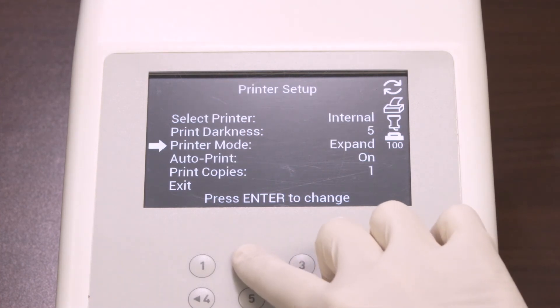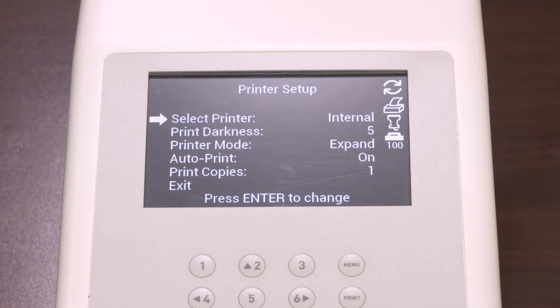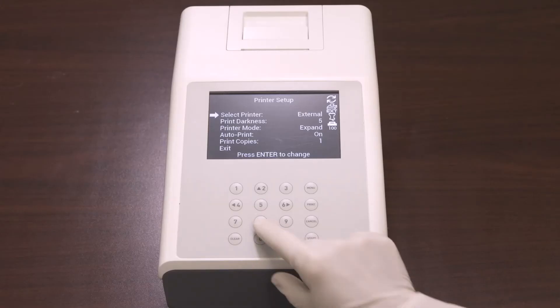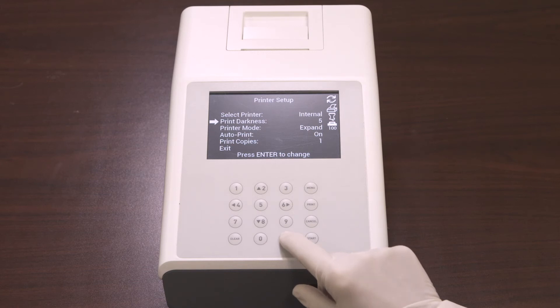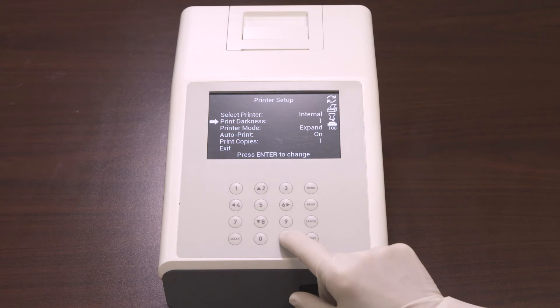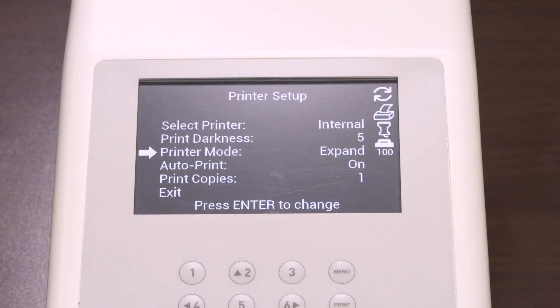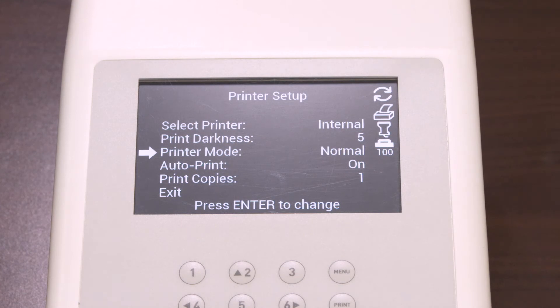Choosing internal in the select printer option prints the results on the internal printer. Choosing external prints the results on an external printer. The next option in the printer setup is print darkness, which provides the level of darkness in the display. It ranges from 1 to 9; the darkest is 9 and the default is 5. The next option is the printer mode: selecting normal prints the standard font size, while selecting expand prints a larger font size.